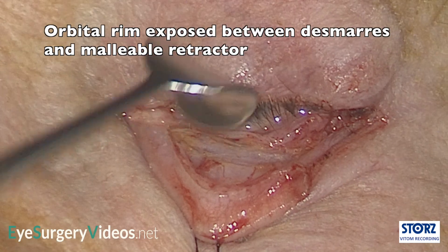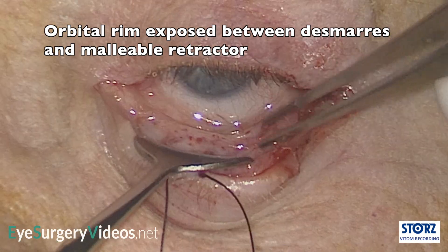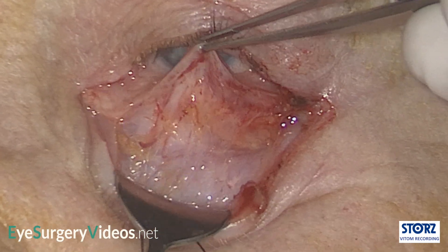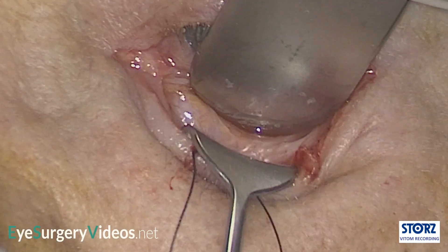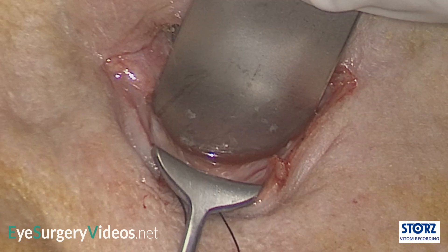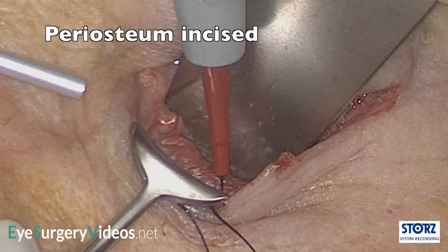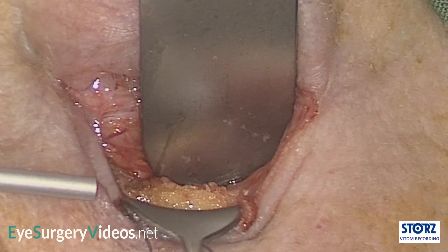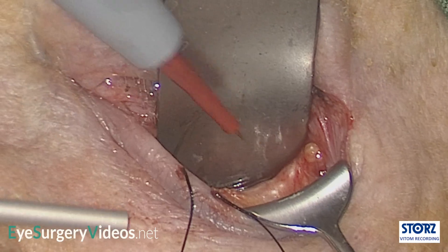The inferior orbital rim is brought into view by retracting the lower lid anteriorly and inferiorly with a Desmarres retractor and using a malleable retractor to retract and protect the globe. The tissues stretched over the orbital rim and the periosteum are incised, here being done with a Colorado monopolar on the cutting setting. Care should be taken medially as the inferior oblique origin is a few millimetres behind the medial end of the inferior orbital rim.